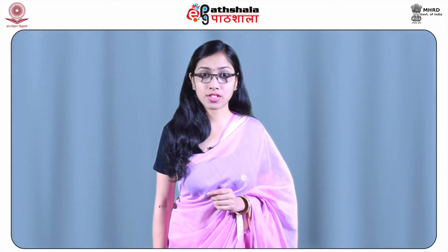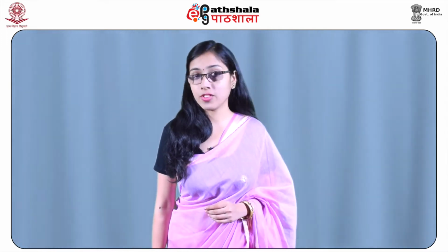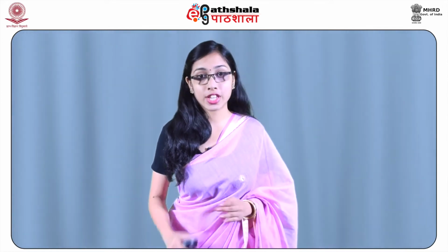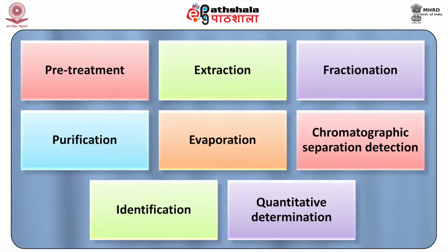Extraction of non-volatile drugs and poisons from the biological specimens can also be accomplished by adsorption process. On the basis of the fundamental principles, the extraction methods can then be developed and optimized with respect to the extraction efficiency. With a high extraction efficiency for the target compound, it should then be possible to create a complete analytical procedure with sufficient overall recovery. A complete procedure includes sample pretreatment, extraction, fractionation, purification, evaporation, chromatographic separation, detection, identification, and the quantitative determination.